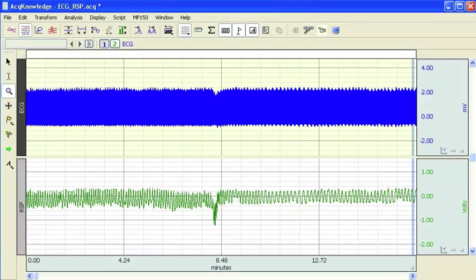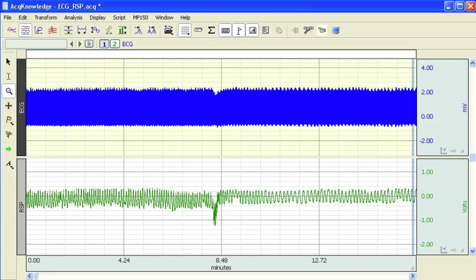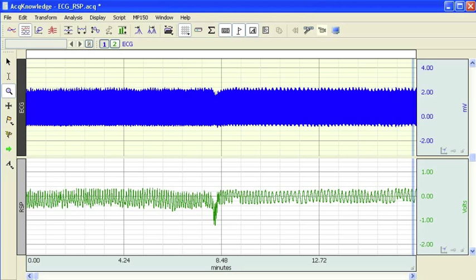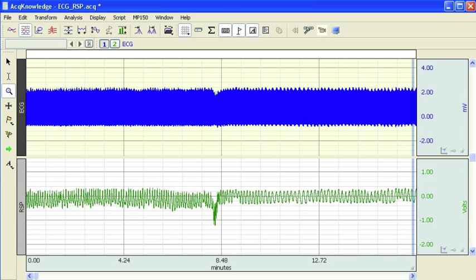The following screencast will provide a demonstration of the ACKNOWLEDGE respiratory sinus arrhythmia analysis module. This particular method is based on a time domain method which was published by Grossman et al. in Psychophysiology.